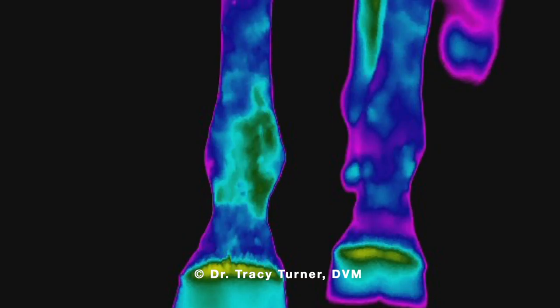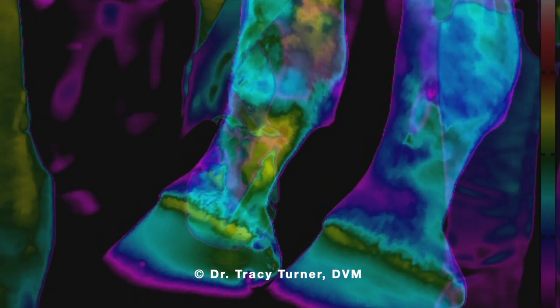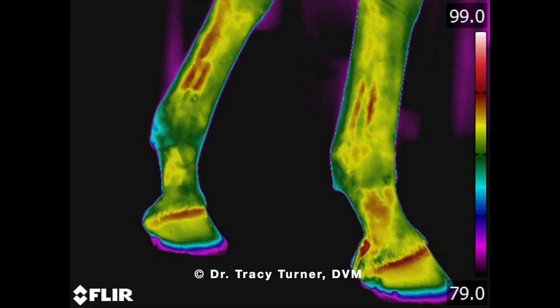In this next sequence of thermal images, I applied the Hoof Pro to the right front foot and provided a 10-minute Equipulse PEMF session. Immediately after, we removed the Hoof Pro and Dr. Turner took thermal images. As you can see, the right front shows an elevated thermal signature in comparison to the left front. The elevated thermal signature encompasses the entire limb, which according to Dr. Turner indicates increased circulation. This is really important because it does show efficacy of the application.